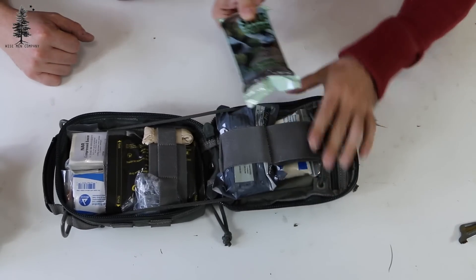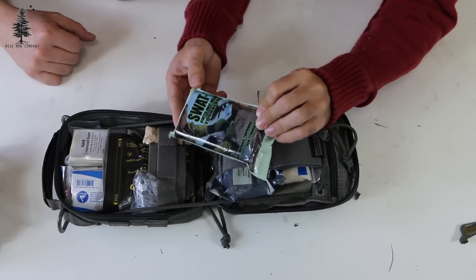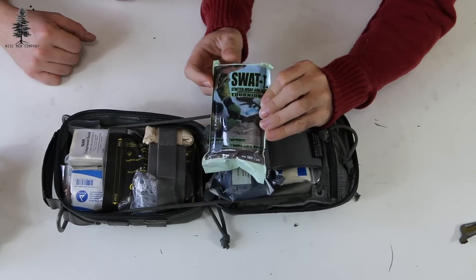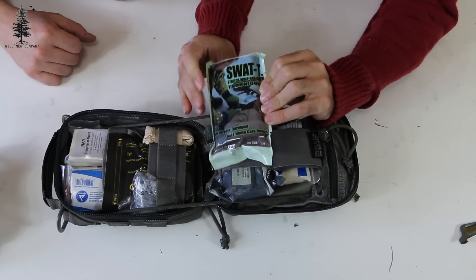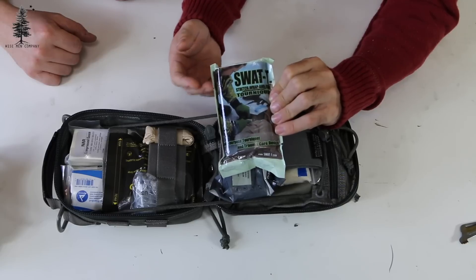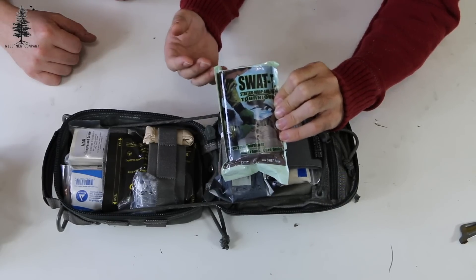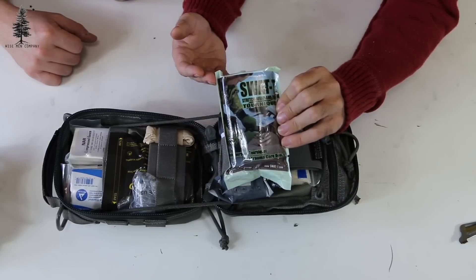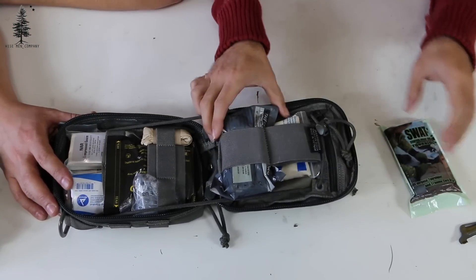First thing here is a SWAT-T tourniquet. These things are great. They make great tourniquets for small limbs — children, things like that — as well as animals. They use them a lot with service dogs and things like that. They also make great pressure bandages, and we carry these. We love these. They're very nice to have.